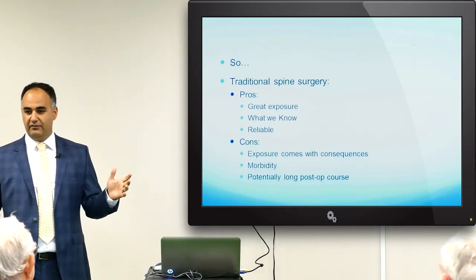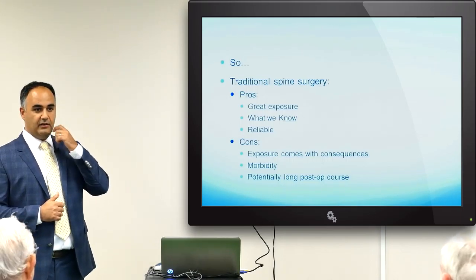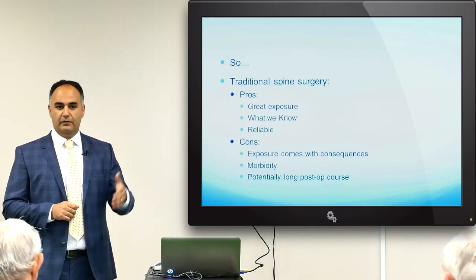I get to see everything very easily. It's wide open. This is what we know how to do. Everyone who's ever done spine surgery has done traditional open spine surgery. And it's reliable. I mean, every time I do it, I know exactly what I'm going to see and what I'm going to come across.